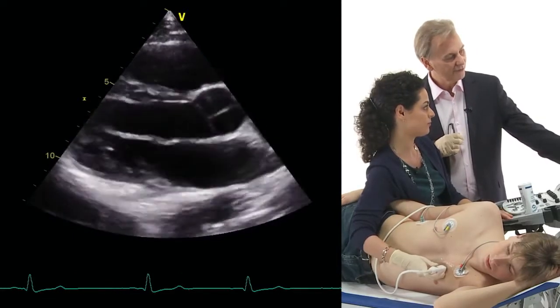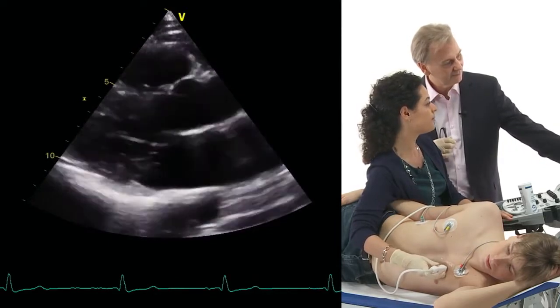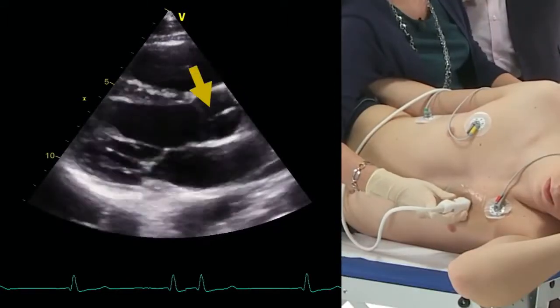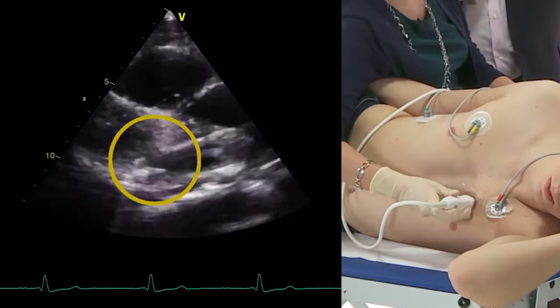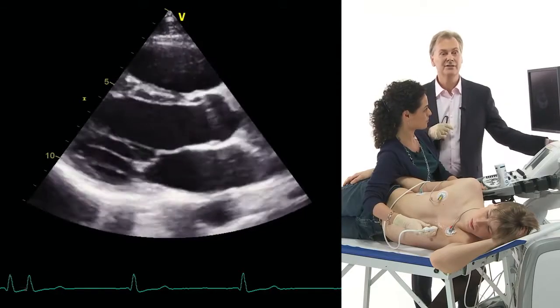So what are some of the structures we're seeing here? Or where is the aortic valve actually? The aortic valve we can really appreciate on top. We see two cusps and a line of coaptation, and the valve we see right below is the mitral valve. Okay, and there's another important structure that we can see here that we want to discuss in this chapter.